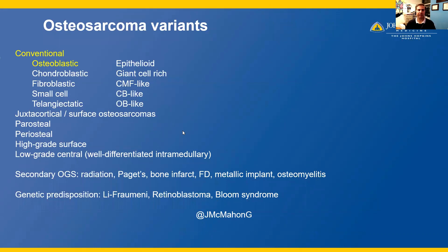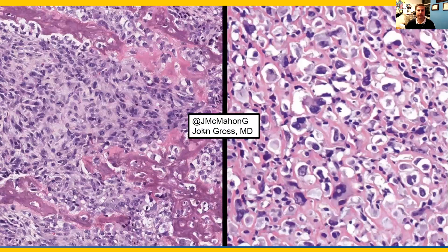There are many different osteosarcoma variants. Osteoblastic osteosarcoma is a type of conventional osteosarcoma. Conventional osteosarcoma osteoblastic type is one of the most common osteosarcoma variants. Here on the left is an example of this subtype with these malignant cells directly producing mineralized osteoid matrix, which is this pink and purple material that the sarcoma cells produce directly.